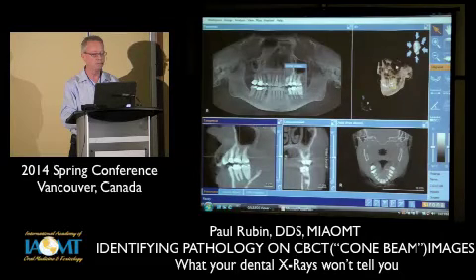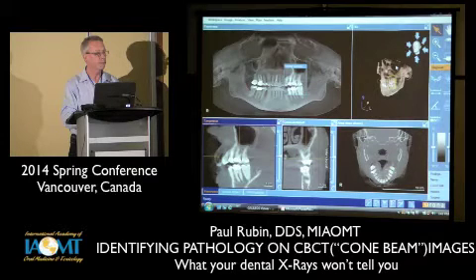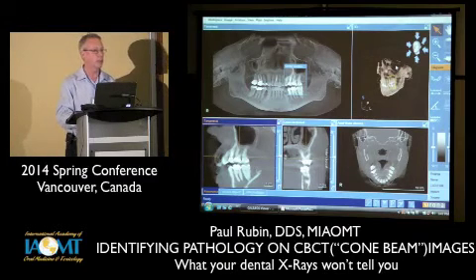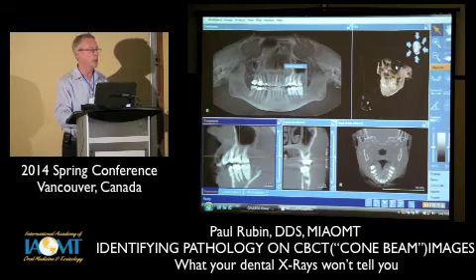I'm going to interrupt, but I have the same machine as you. Let's say that you did this scan like I did as well, and you find one that's rock solid, every dimension. What do you say then? So the question was, what if I look at an image and we see a root canal that just looks rock solid, the bone looks just perfectly fine all around it? What do I say to my patients there?